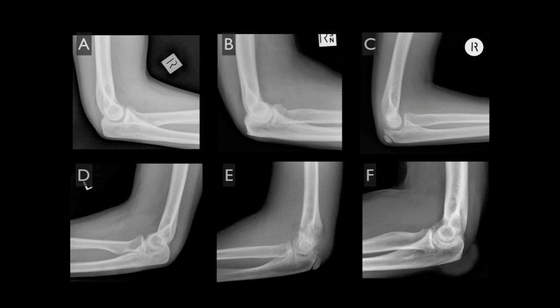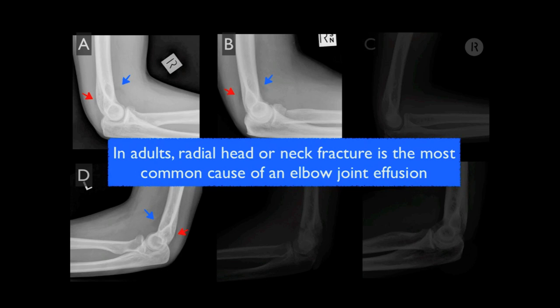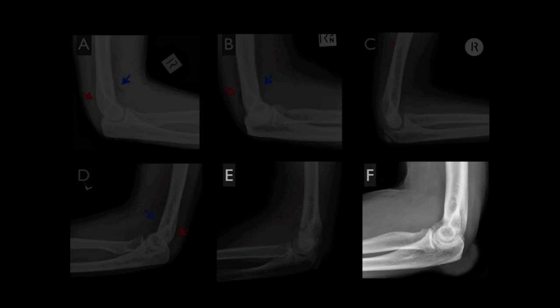Let's return now to our six cases and see how many effusions we can find. A, B, and D are all adults with joint effusions, each demonstrating sail signs and posterior fat pad signs. B is the patient we have already seen with the radial neck fracture, while A and D have subtle radial head fractures, which are the most common cause of an elbow joint effusion in adults.